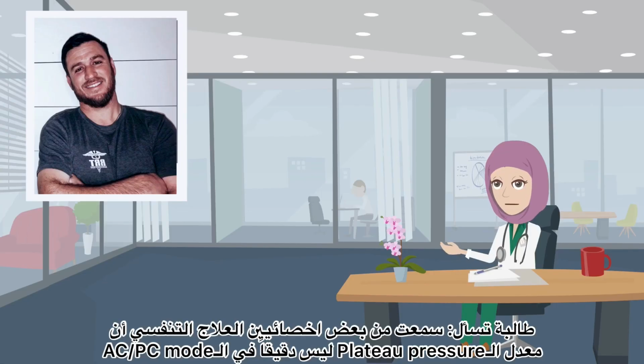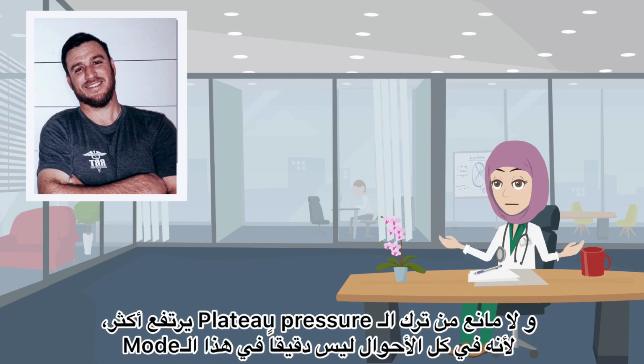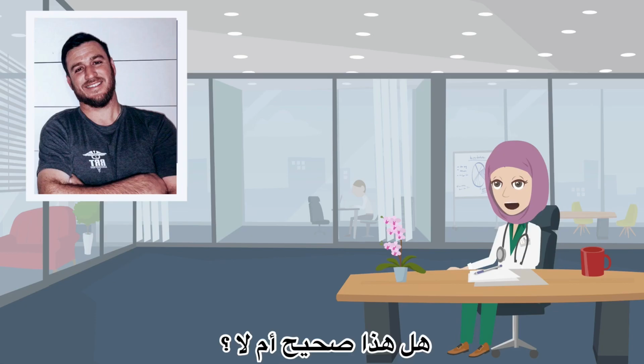A student is asking, I heard from some RTs that the plateau pressure is not accurate in the A/C PC mode. For example, she said, if an ARDS patient on the A/C PC mode has a plateau pressure of 35 cm of water, it is okay to increase the PEEP and let the plateau pressure get higher because the plateau pressure in this mode is not accurate. Her question for you is, is that true or not?